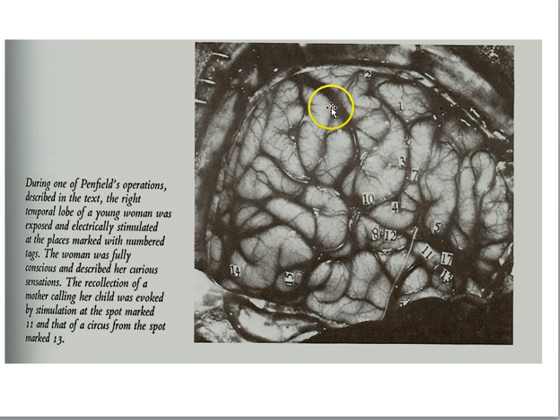Here we see the surface of the brain, and we see some arteries servicing every nook and cranny of that brain. So again, the idea is if this area down here, they've just put a little number there, 14, if that area is active for some particular task that the person is doing, the local blood vessels in that area will start to increase the blood flow to that area. And that's going to be the key to this functional MRI technique.